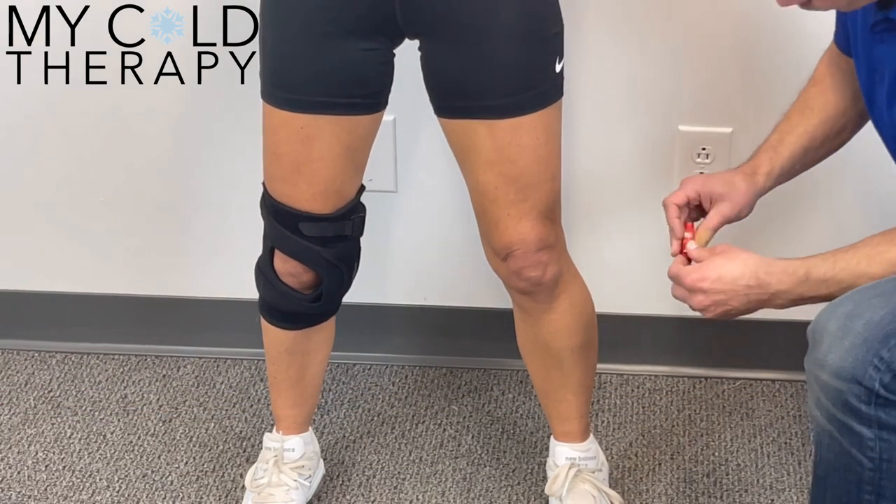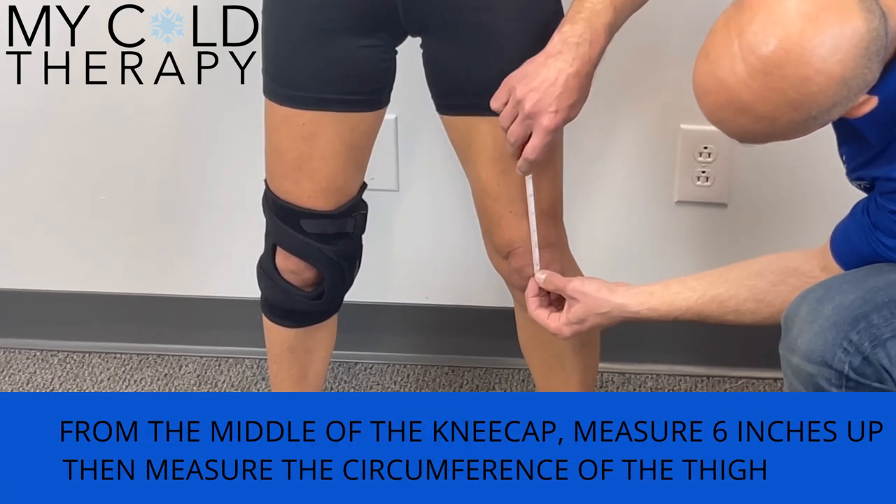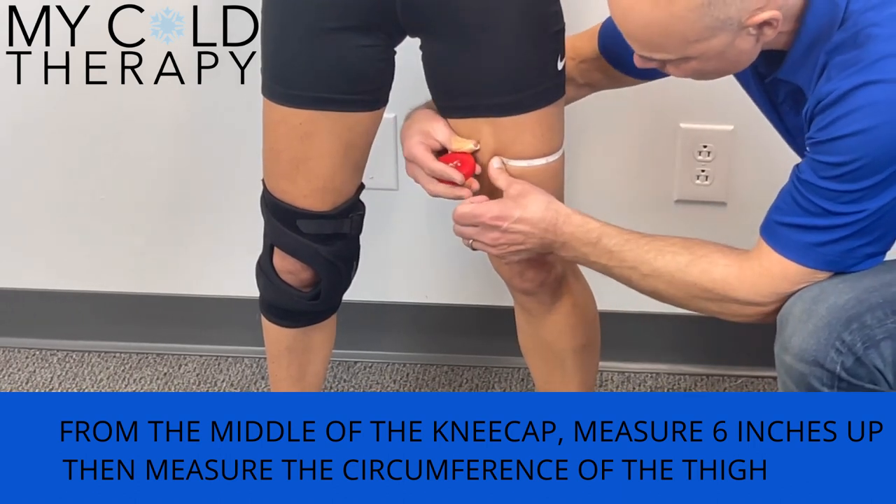The second measurement: take the tape from the middle of the kneecap and measure 6 inches up towards the thigh, and get a measurement there.